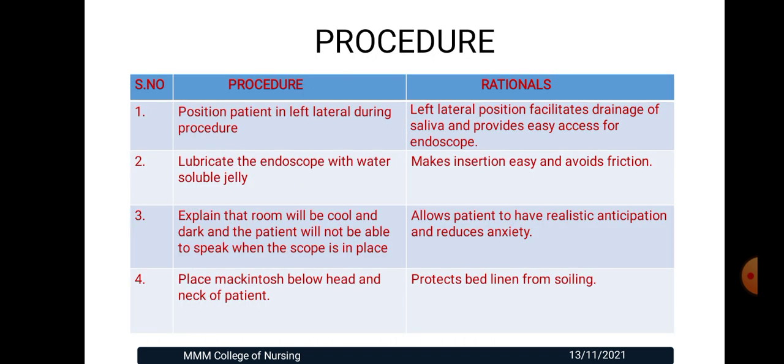Procedure. First point, position patient in left lateral during procedure. Due to left lateral position, it facilitates the drainage of saliva and provides easy access for the endoscope. And lubricate the endoscope with water-soluble jelly. Rationale is it makes insertion easy and avoids friction.